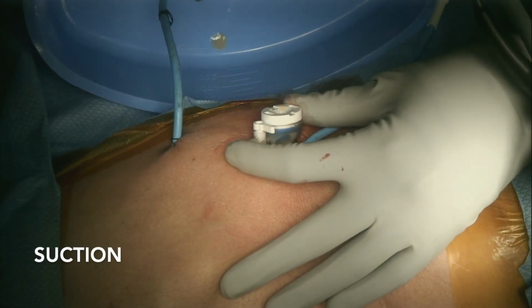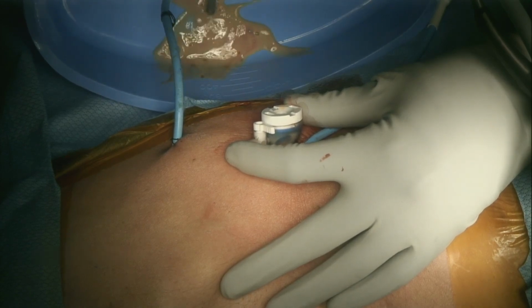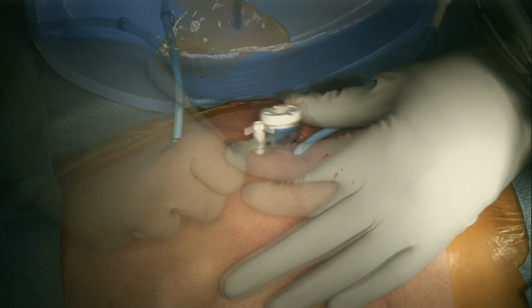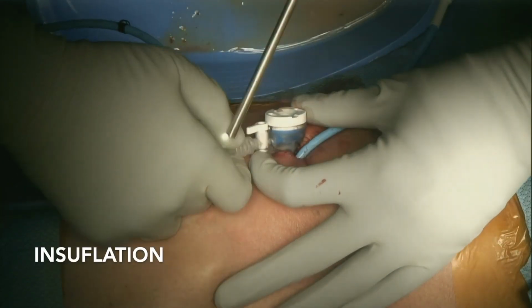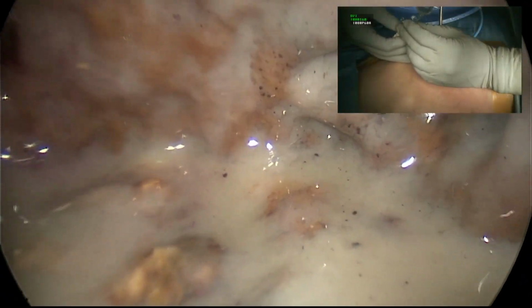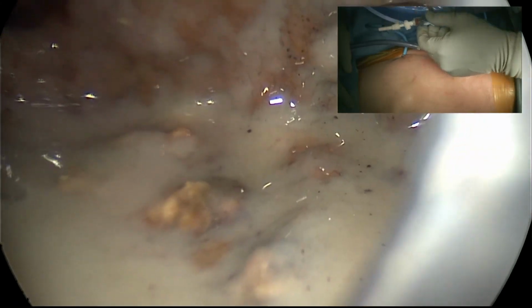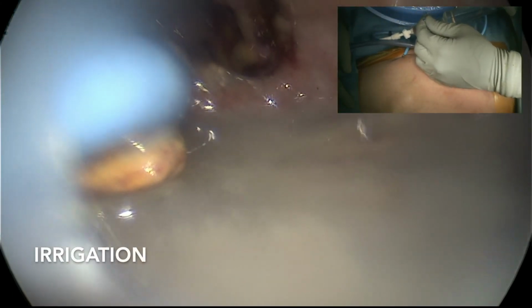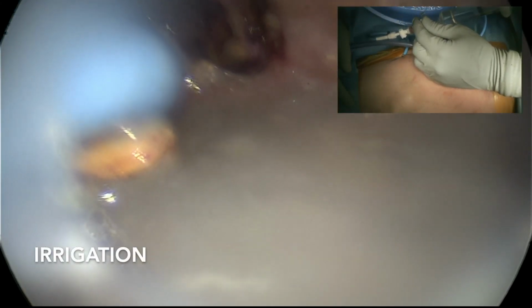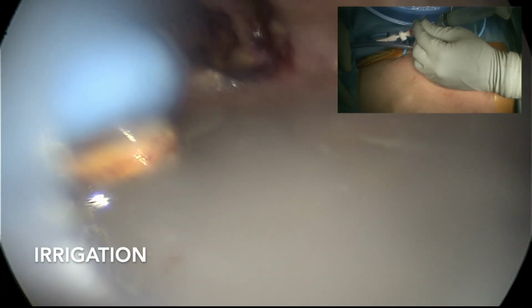Once we were comfortable with the depth of the retroperitoneal cavity, the 5 mm trocar was replaced with a 12 mm large trocar and entered the retroperitoneal cavity again. The cavity was irrigated multiple times using the left upper quadrant trocar, while the lower big trocar was used to suck out all the debris using the suction, which was introduced to the depth calculated earlier.